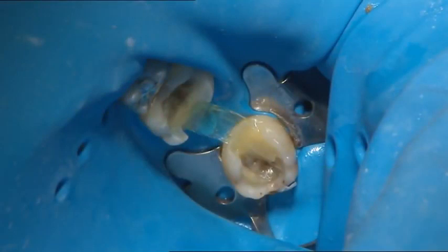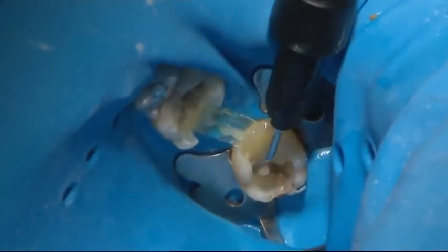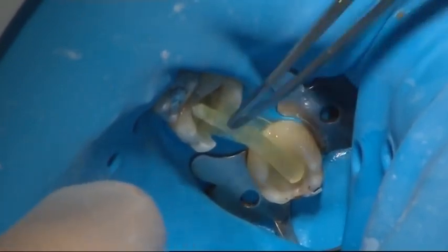For maximum reinforcement, the fibre was bent towards the gingiva. However, enough space was left for cleaning. The second fibre layer was attached using flowable composite and light cured in place.